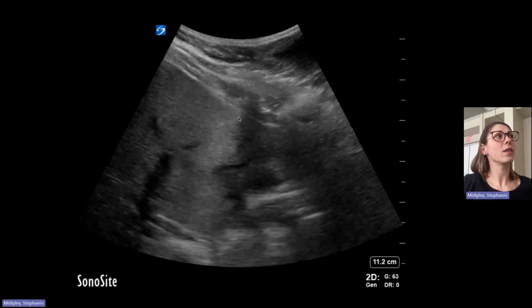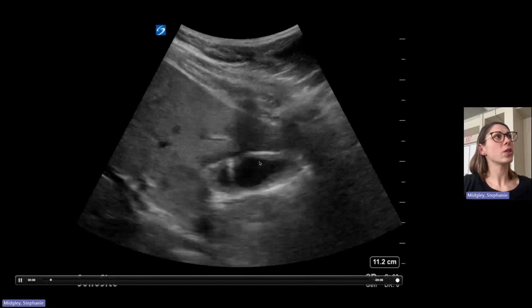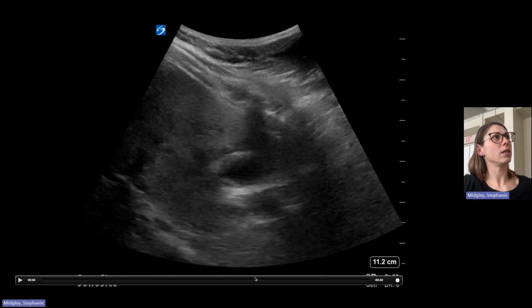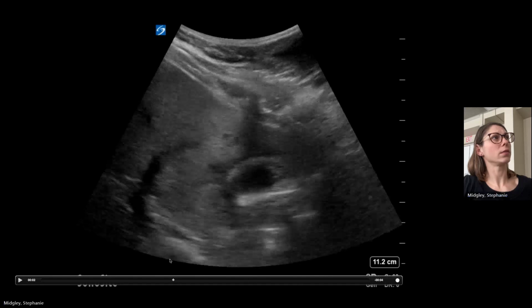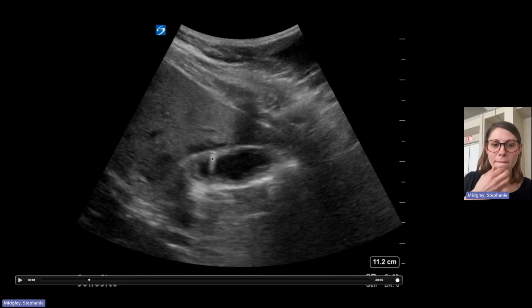All right. So this is adenomyomatosis, right? Essentially you get cholesterol deposits built up in the gallbladder wall, and you get these focal areas of comet tail artifacts. There you go. I was just standing there with residents and we were like, it's B lines. And then I went home and was reading about this, about the B line, like a comet tail.